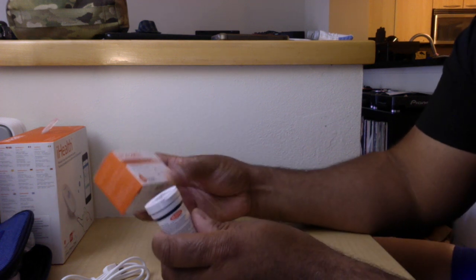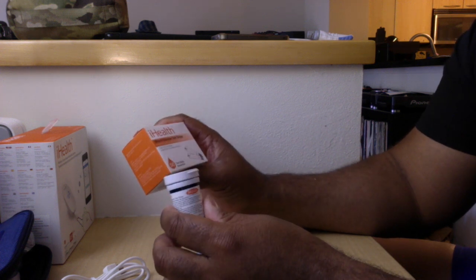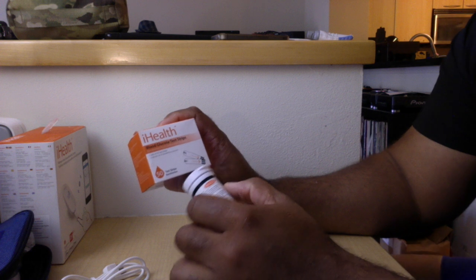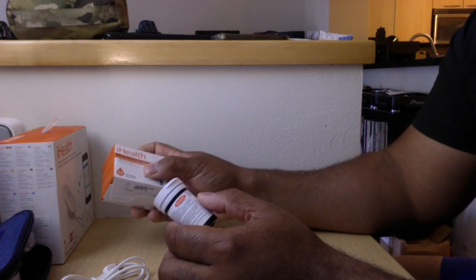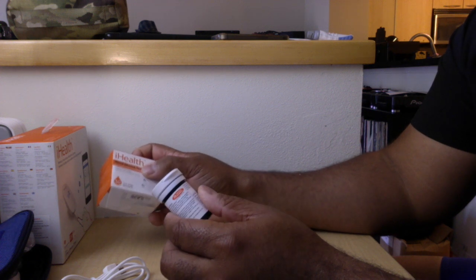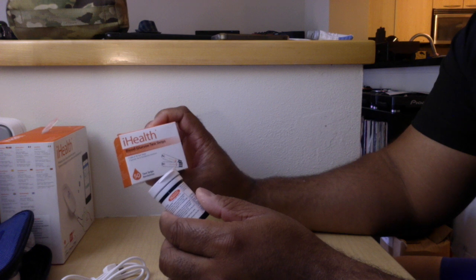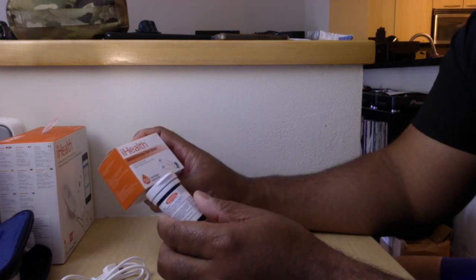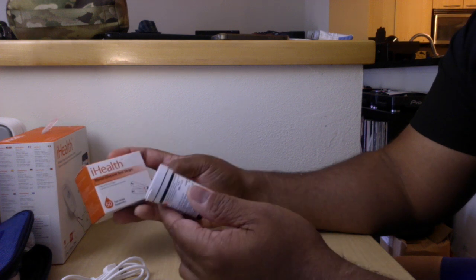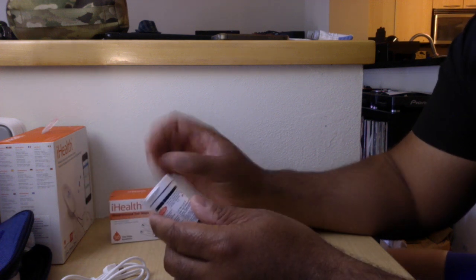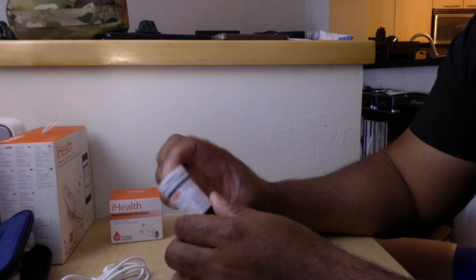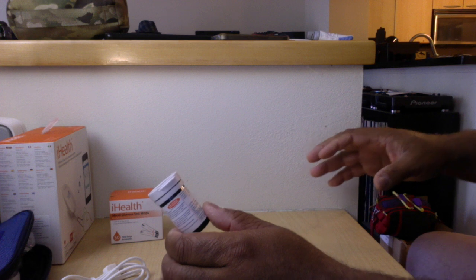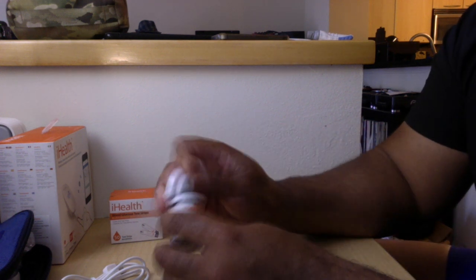So I don't expect to be buying a lot of these, but I don't really see any problem with that. Some of these, I guess they're called no-code strips. I actually have some because I brought another meter to test the accuracy to see which one is better. I would prefer no coding just in case I wanted to keep these around, but I don't think it's going to affect me. That's something to consider.